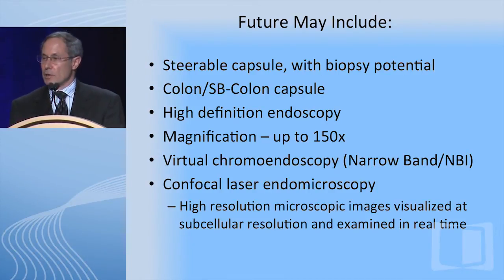What about the future? Well, I think the future is bright in inflammatory bowel disease and in endoscopy for IBD as well. Possibilities include a steerable capsule with biopsy potential, a colon capsule, or more likely a combined small bowel and colon capsule.